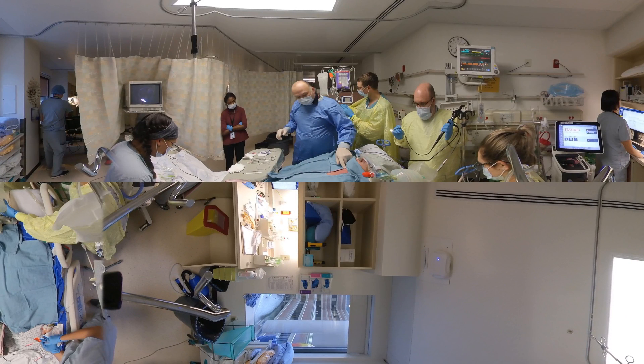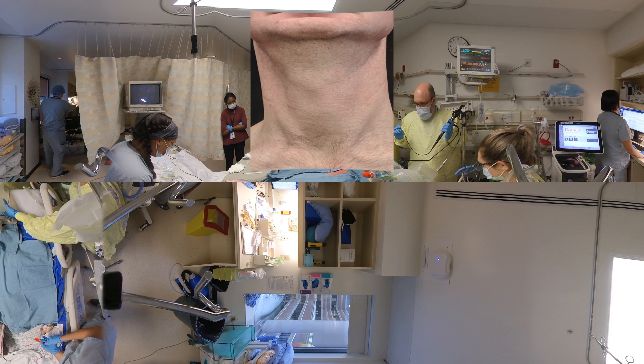This gentleman is in the intensive care unit, currently intubated and mechanically ventilated with respiratory failure. He requires a tracheostomy as a bridge to weaning. His neck is prepped and draped using sterile technique, following which we landmark out the neck, including palpation of the thyroid cartilage and palpation of the cricoid cartilage.